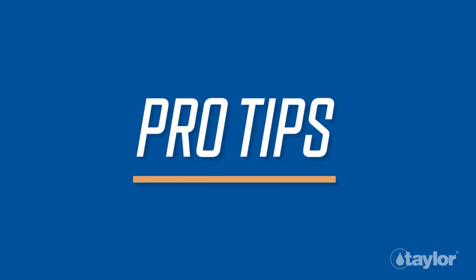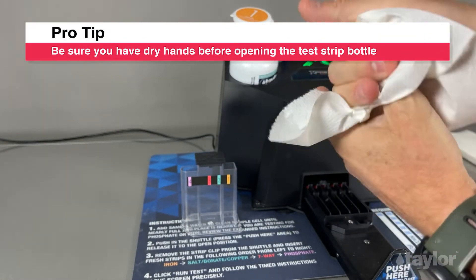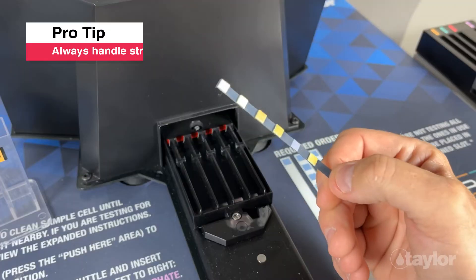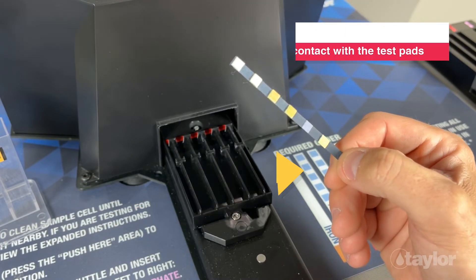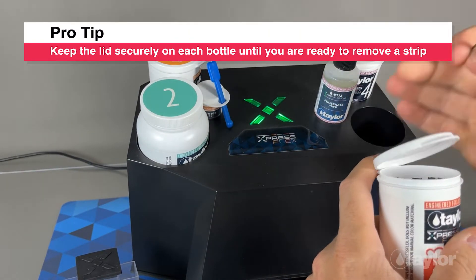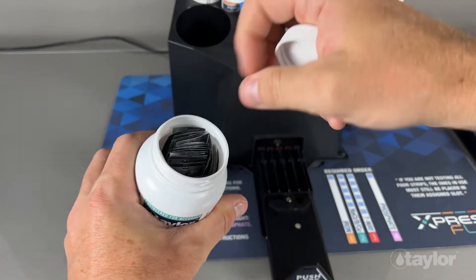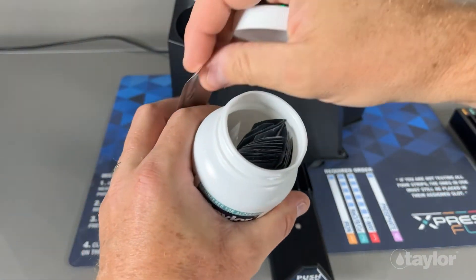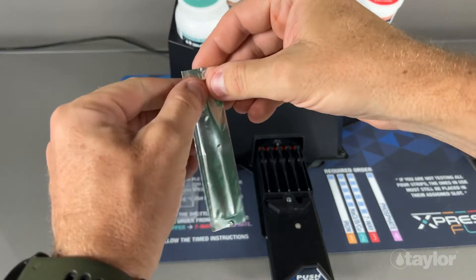Pro tips for handling test strips: be sure you have dry hands before opening the test strip bottle. Always handle strips from the bottom to avoid contact with the test pads. Keep the lid securely on each bottle until you are ready to remove a strip. The Flex 2 strip is packaged in an individually foiled sleeve — this packaging helps protect the strip from sunlight, which can degrade the salt test pad.